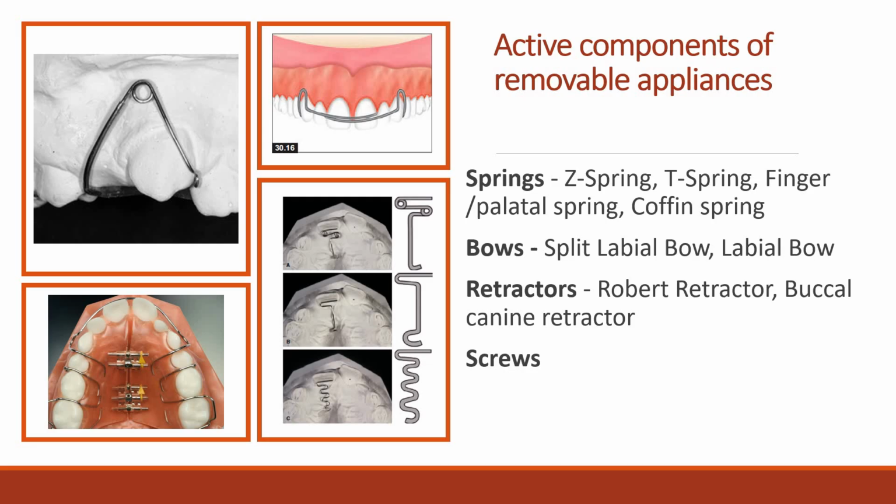Removable appliances are not permanently attached to the teeth and can be taken out of the mouth by the patient. During the first half of the 20th century, orthodontic practice in Europe was based largely on the use of removable appliances. However, over the past few decades, there has been a significant decline in their use, primarily as a result of more efficient fixed appliances being available and an increase in numbers of orthodontic specialists able to use them.